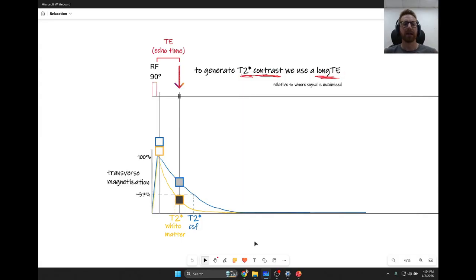And I should point out briefly, we talked about dark protons in the earlier part of this lecture when we were talking about tissues that have intermediate density on proton density weighted images. We said that some of those protons associated with macromolecules did not generate detectable signal, and so they're considered dark protons. The reason is because those protons are so rigid, so tightly bound, that their T2 star is so short that we can't detect them. So if you're wondering about why the protons are dark, that's part of it.